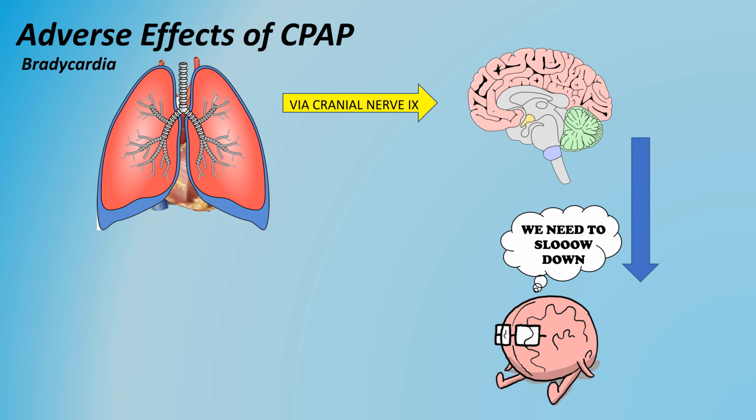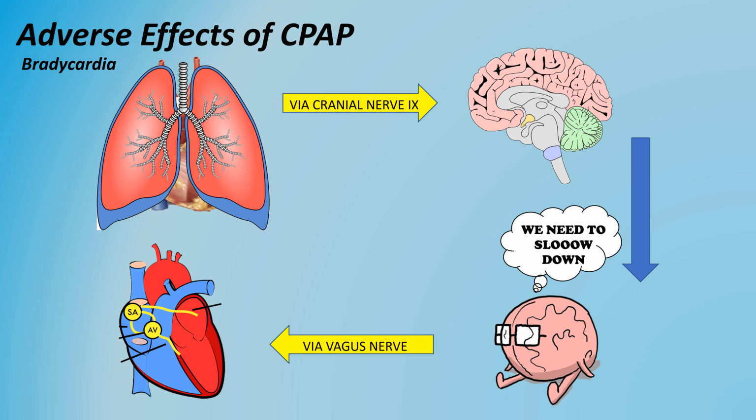If this occurs, you can also try reducing your CPAP settings to the last hemodynamically stable point and see if this reverses the effects. If you're lucky enough to have a partner working at the intermediate level, this is also a great time for them to break out the atropine. Bradycardia caused by vagal stimulation is often reversible with atropine and can be attempted before reducing or discontinuing CPAP.